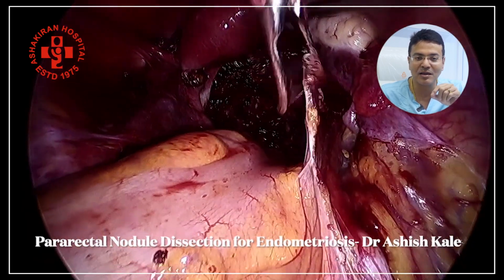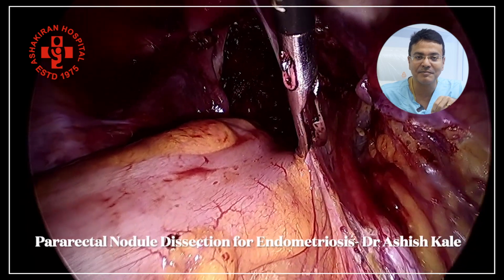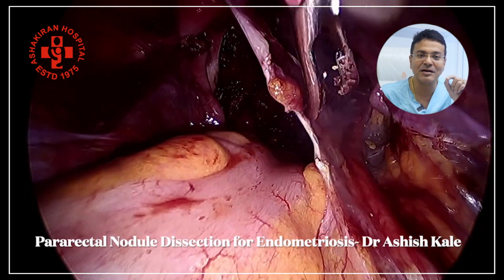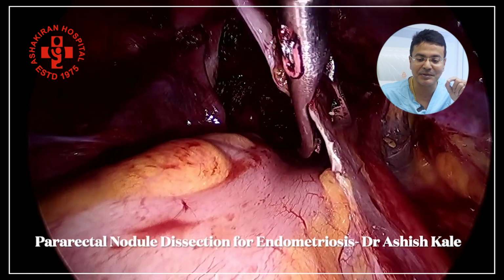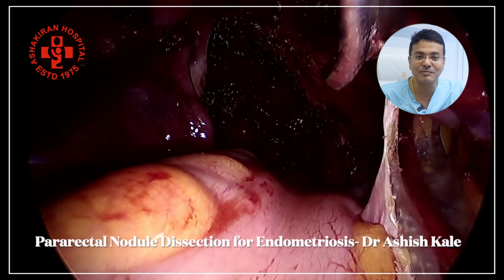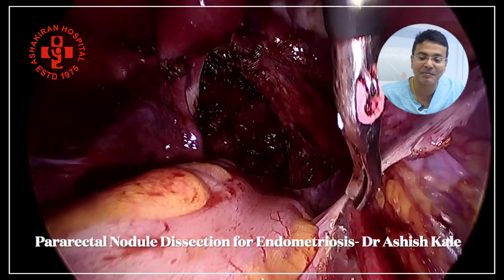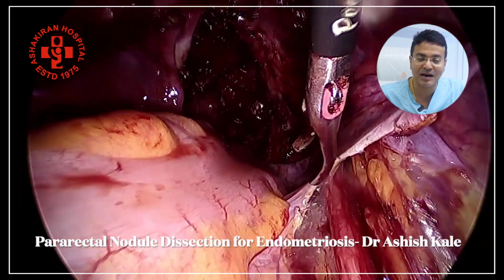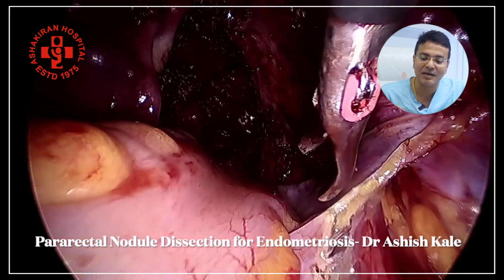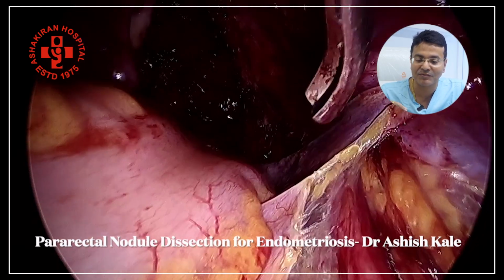Here the ureter is already dissected and now we are dissecting the pararectal space. When we started the dissection of the pararectal space, the uterosacral in this patient was involved. So once the ureter is lateralized, what remains parallel to the ureter is the uterosacral and the pararectal space. Here the nick by nick dissection is done in order to separate the ureter.